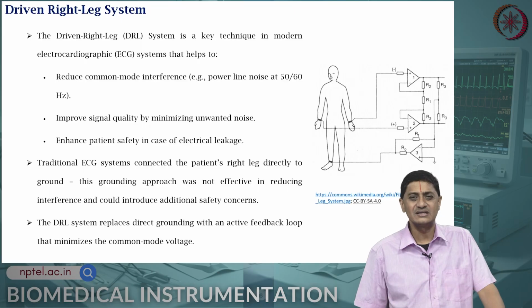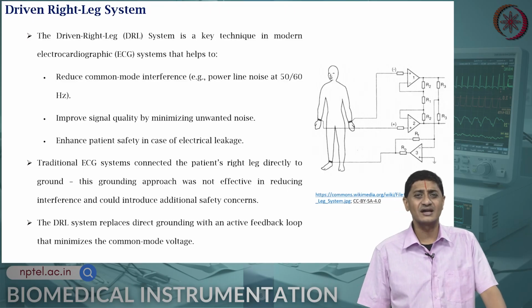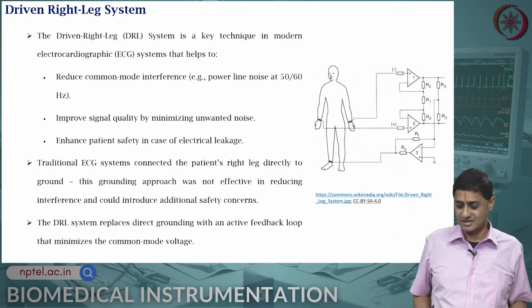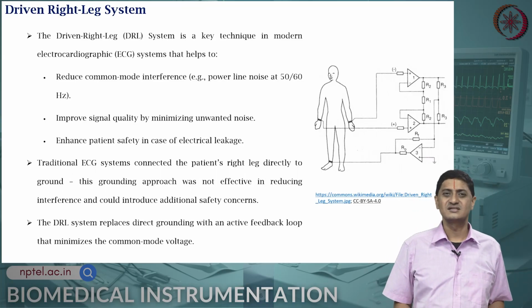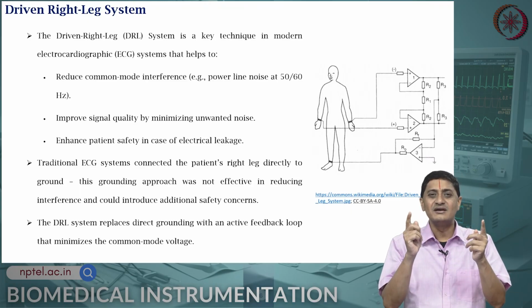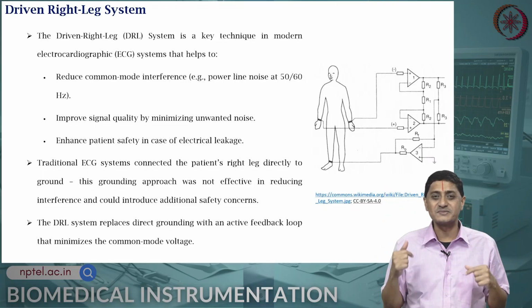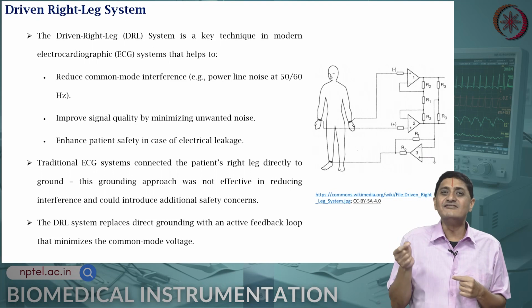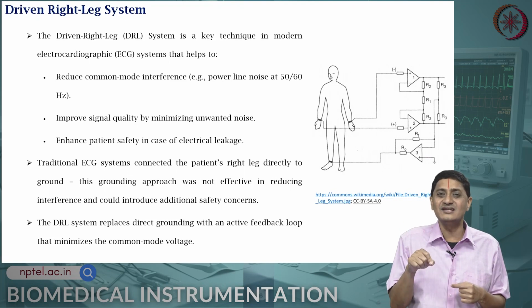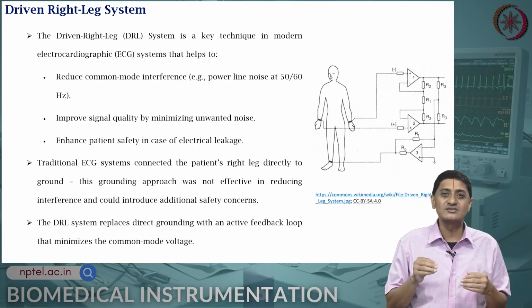So, consider this similar to active noise cancellation in headphones. Many of you might have active noise cancellation headphones. When you are hearing some music, it has microphones through which it measures the ambient noise, and then it inverts that noise and actively inputs the inversion into your ear, so that you don't hear the ambient noise.